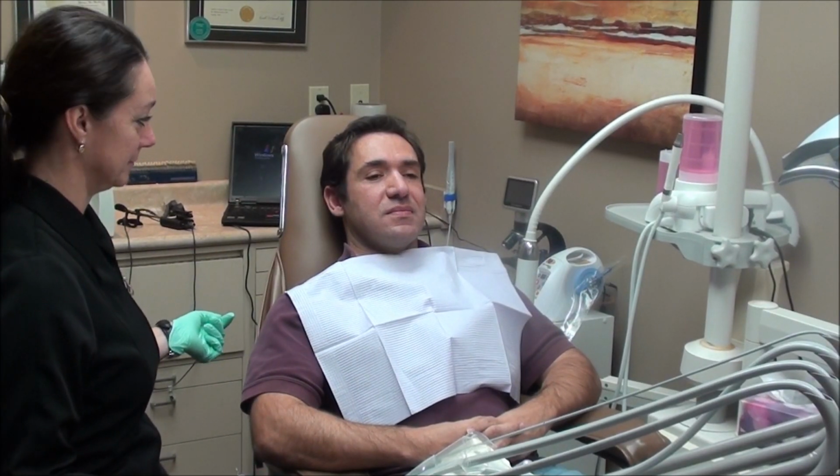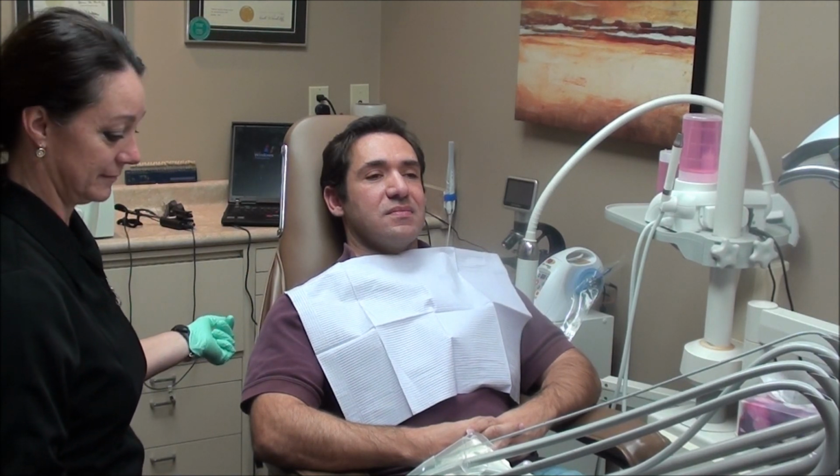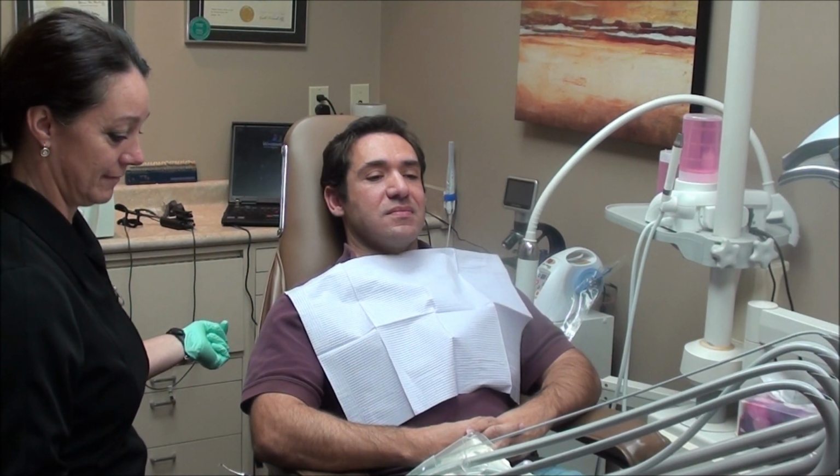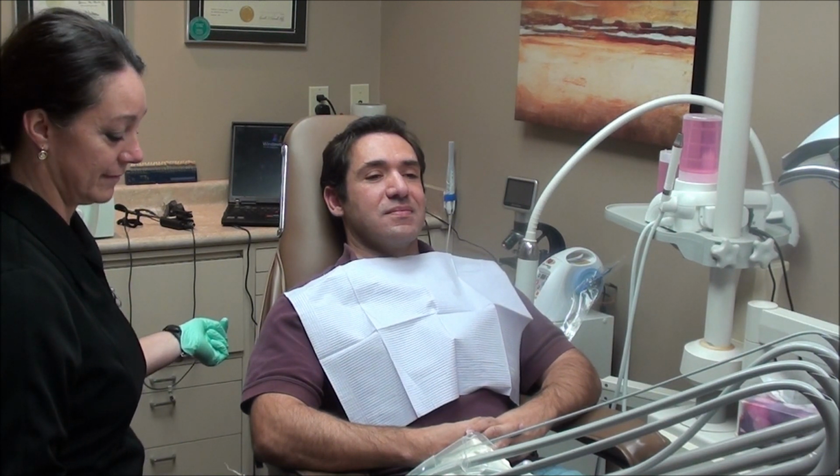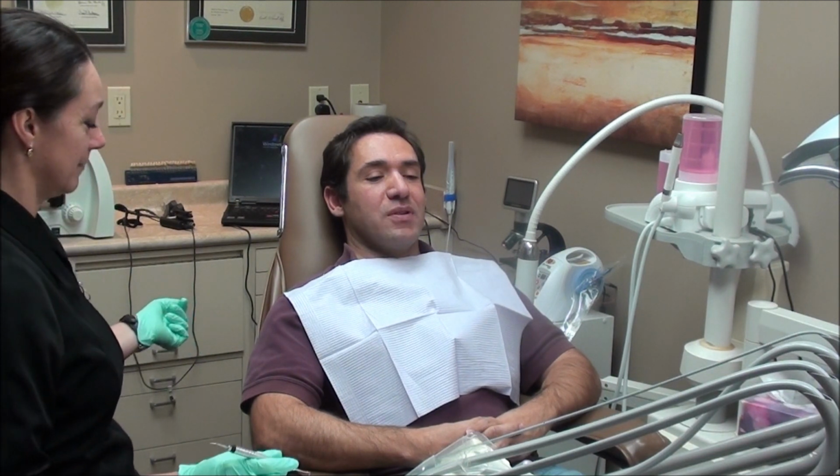You're here today, and what we're going to be doing is taking a look at the bacteria that lives in your mouth, and we want to see if there's any disease-related bacteria. So what we're going to do is take a sample from under your gum line and then view it on the microscope, okay? Sure.